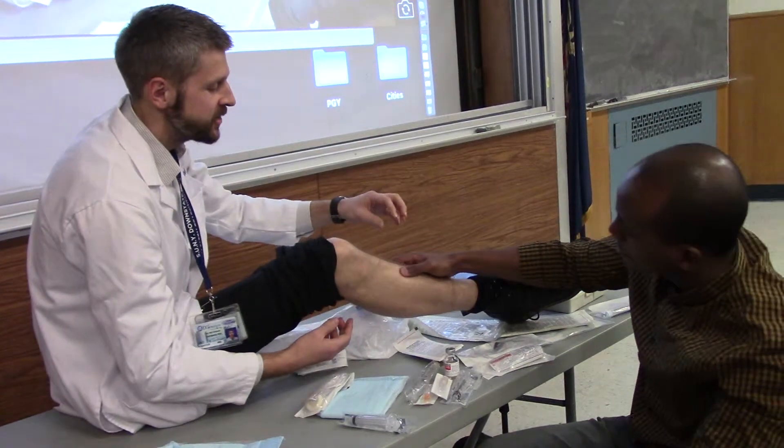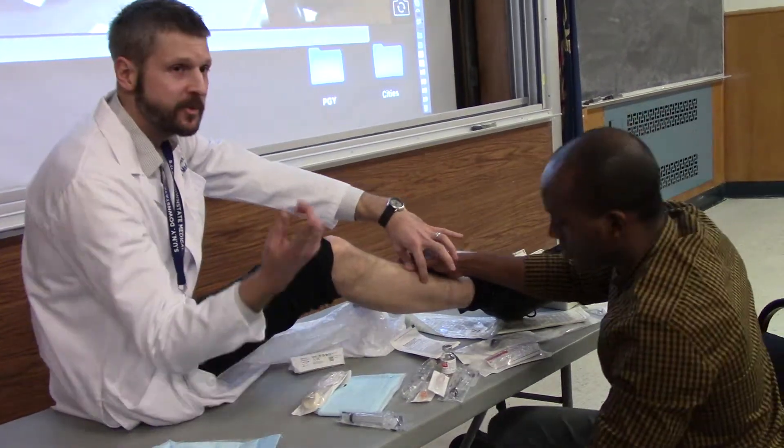So if you palpate your bone, what I was going to do with a marker is really just kind of mark it out so people in the back there can see also.